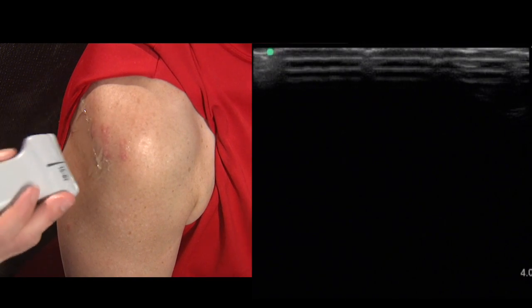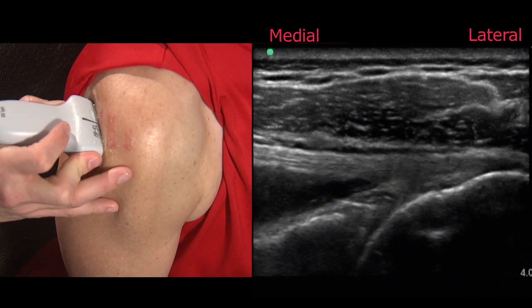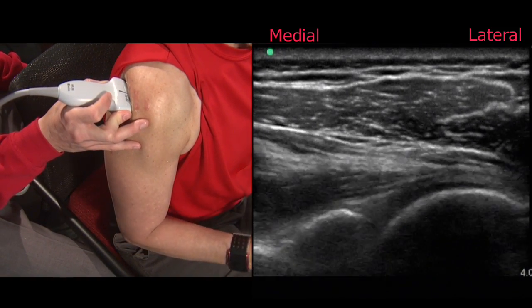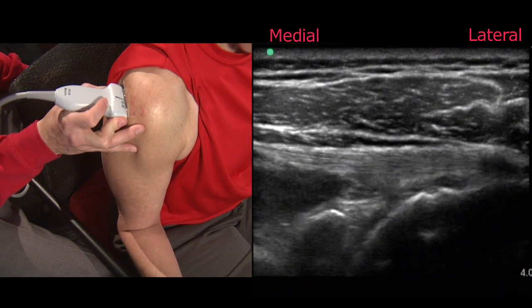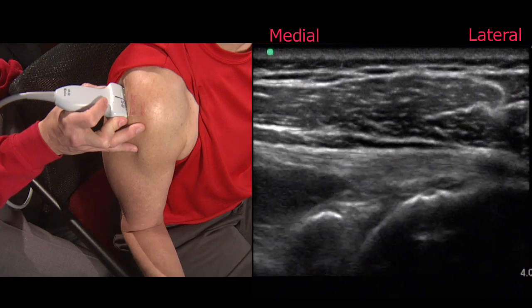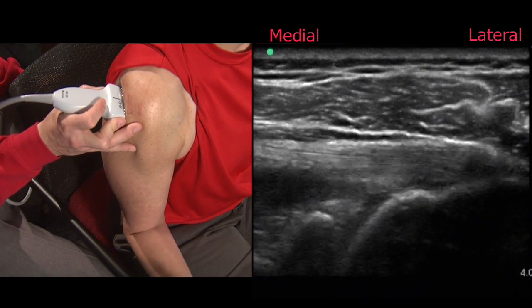Finally, I like to end the exam with an assessment of the posterior joint line dynamically as the patient slowly enters the center position and then internally and externally rotates their upper arm. Here you get a good appreciation of the humeral head articulating within the glenohumeral joint, and you also get a good assessment of just how dynamic that glenoid labrum is. This is also a good position to assess for posterior impingement, as you would look for bunching or pooling in between the two joint surfaces. Once we finish this assessment, that completes our shoulder exam. Thank you for joining us.